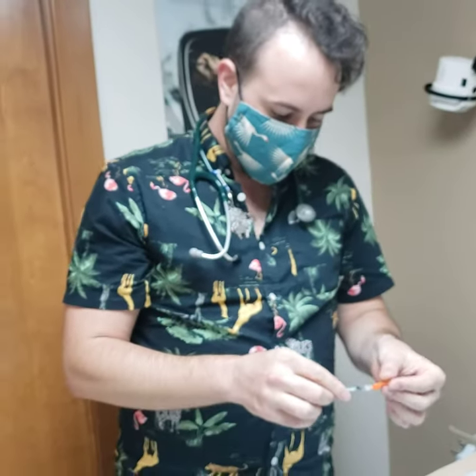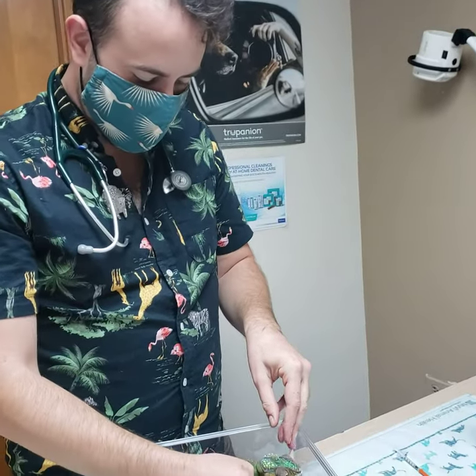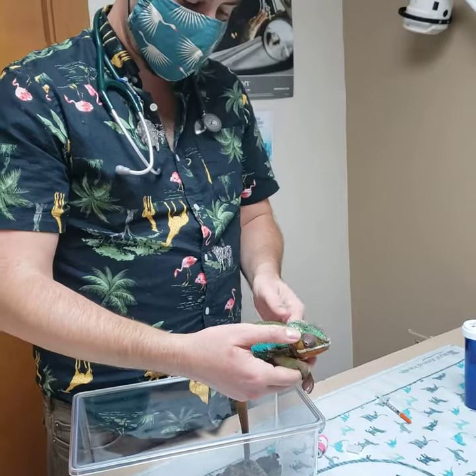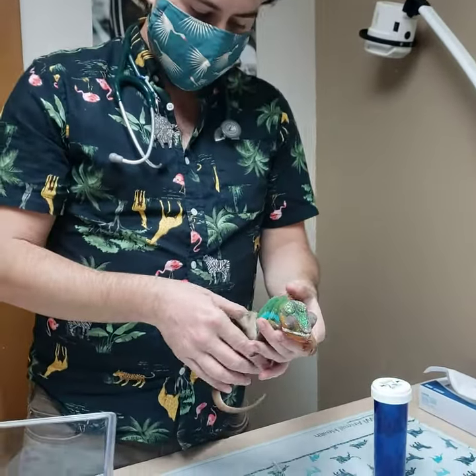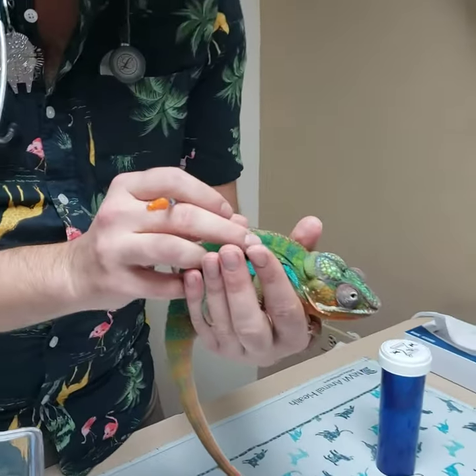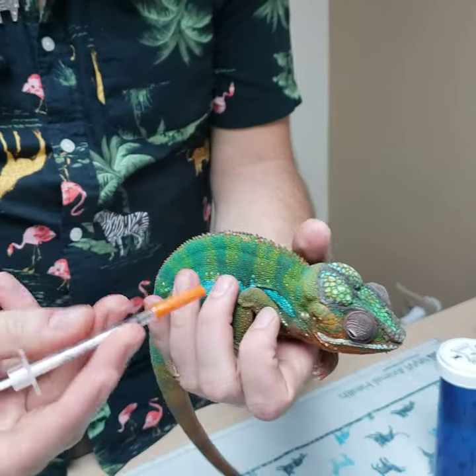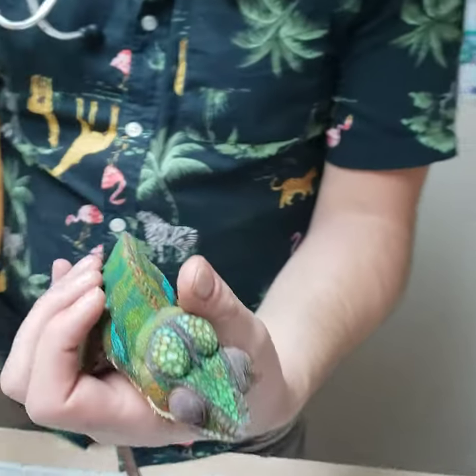The next thing we're going to need to do is position our patient for administration. I usually will have the animal facing away from me, and what we're going to aim to do is inject just under the skin, right next to the spinal ridge here. I'm going to be aiming my needle backwards because he will probably go forwards as soon as I poke him.